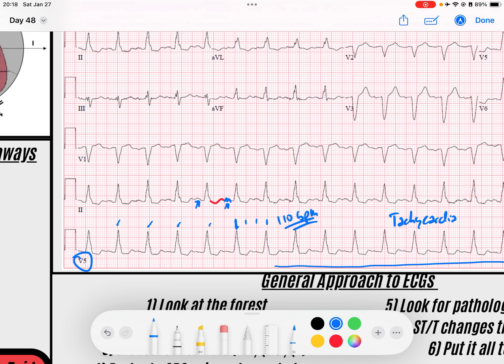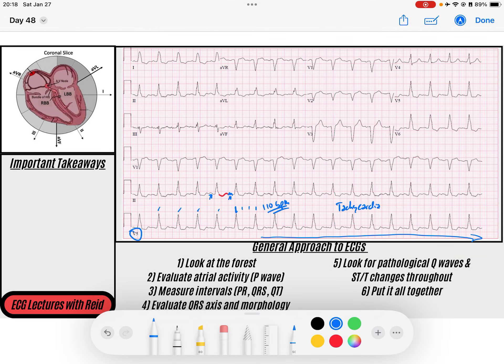So we've got a tachycardia — we've got a wide complex tachycardia — and we need to start narrowing the differential down. What could be going on? What do you think? It could be VTAC. Could this be SVT with aberrancy? Let's just work through it. We said we may have some atrial activity, but what do we notice?